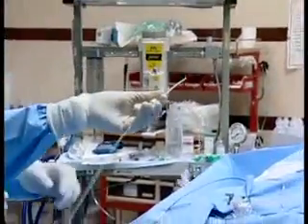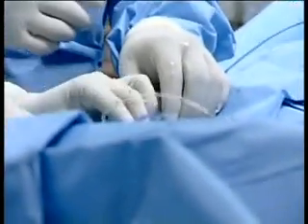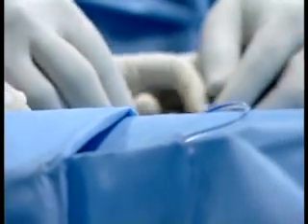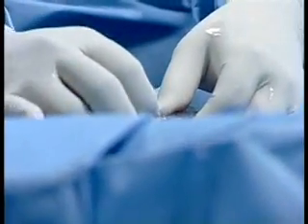The difference between this and the other devices is he's just using a guiding catheter. He's not putting a sheath across the ventricular septal defect. He's just taking the device into the guiding catheter and then releasing it. That actually shortens the procedure and we are able to do it quickly.